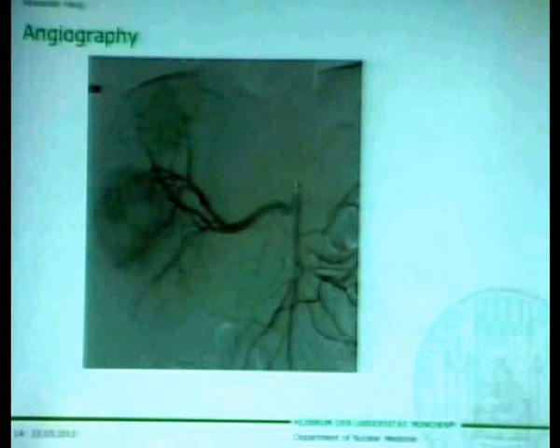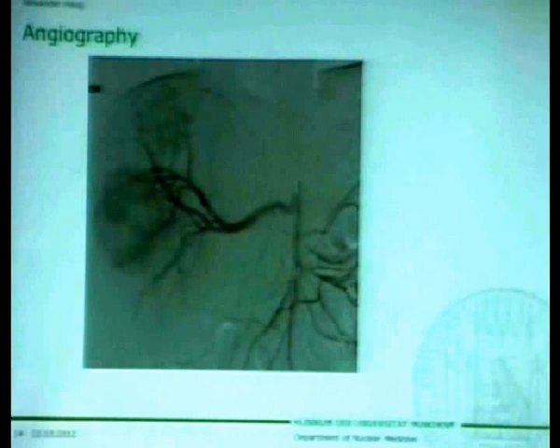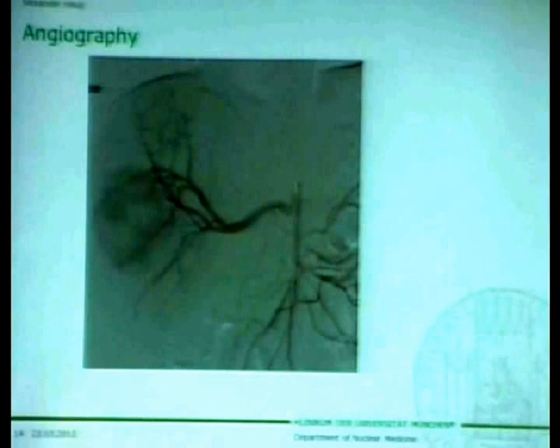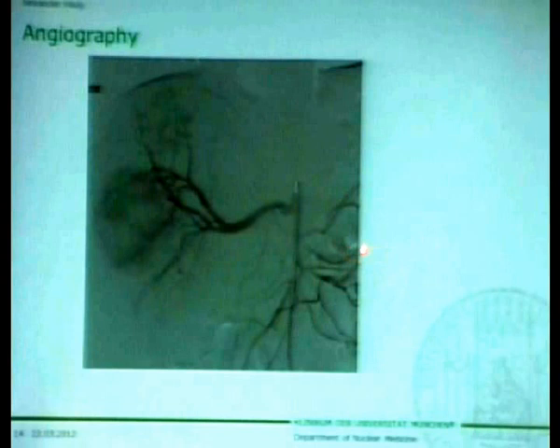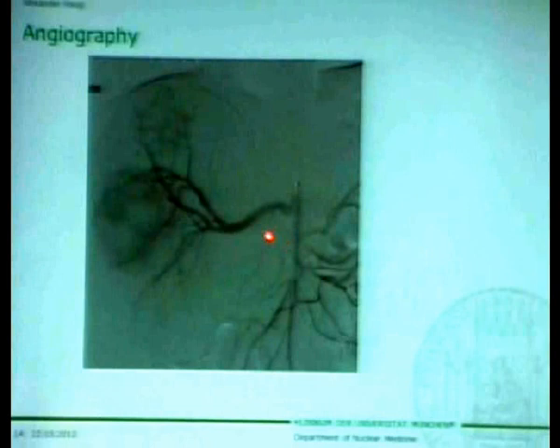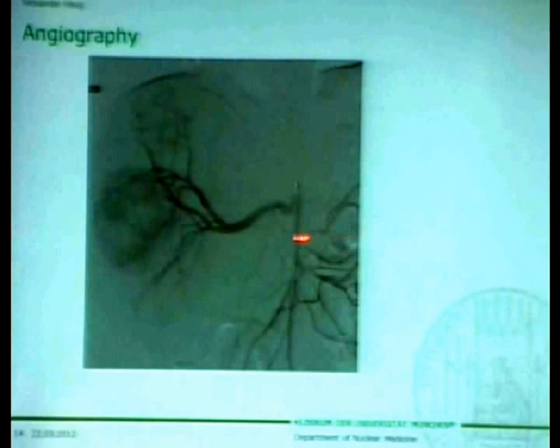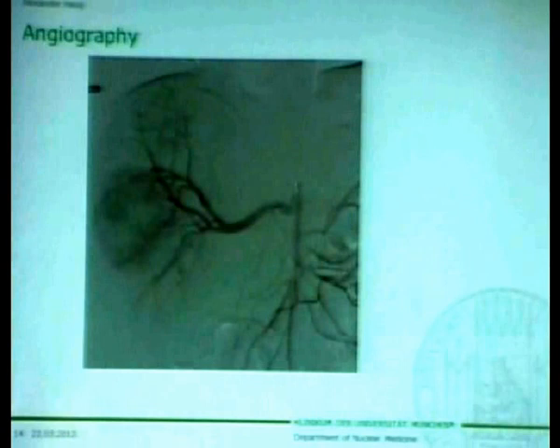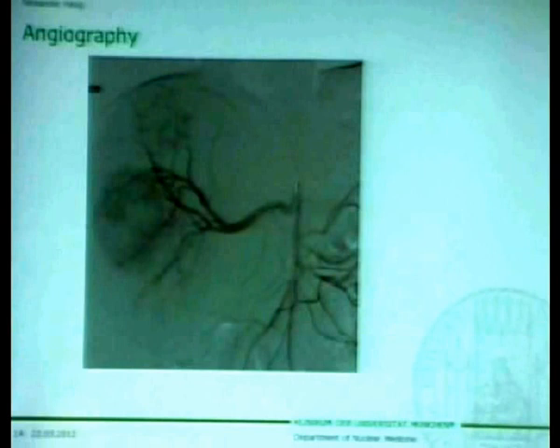I want to show some examples from angiography — this is very important. The anatomy of the hepatic arteries is in most cases not as clear or easy as shown in most textbooks. For example, in this case the right hepatic artery is arising from the mesenteric artery, and there are some branches to the stomach as well. You can see two large liver metastases in the right liver lobe which we want to address. You always have to keep in mind the hepatic arterial anatomy, because this is a strong indicator of how careful you have to be during therapy to avoid side effects.